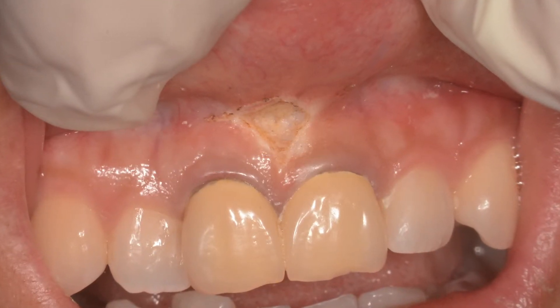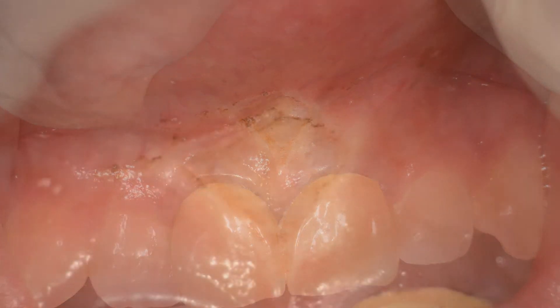When you zoom in here, you can see a nice clean-looking wound that will heal by secondary intention.